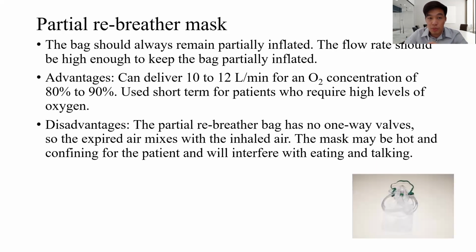Next is the partial rebreather mask. This one has a higher concentration, 80 to 90%, but a lower flow, which is 10 to 12 liters, compared to the earlier non-rebreather mask. And this is normally used short-term for patients who require high levels of oxygen.